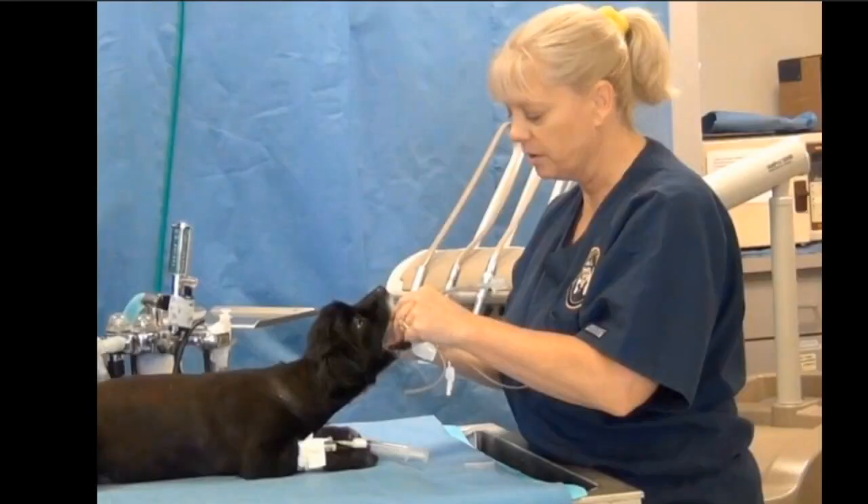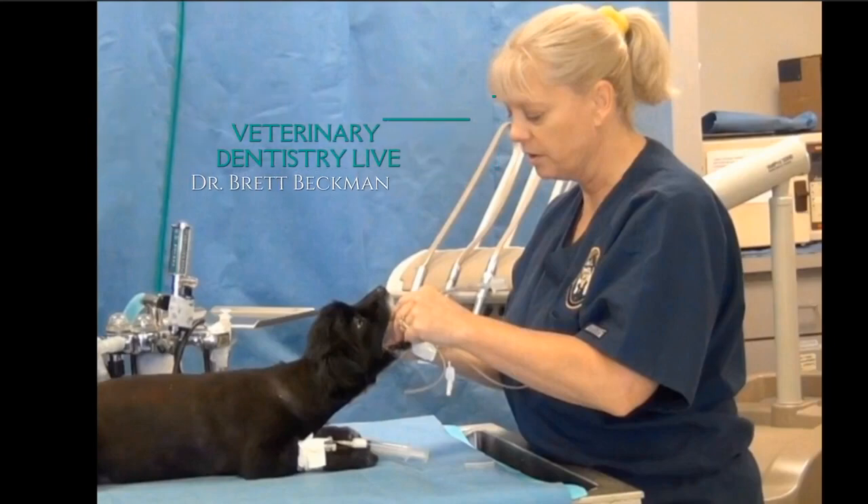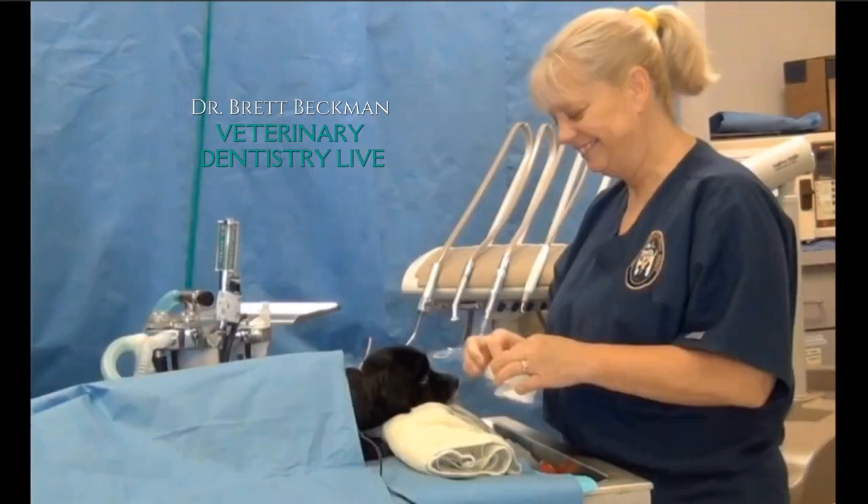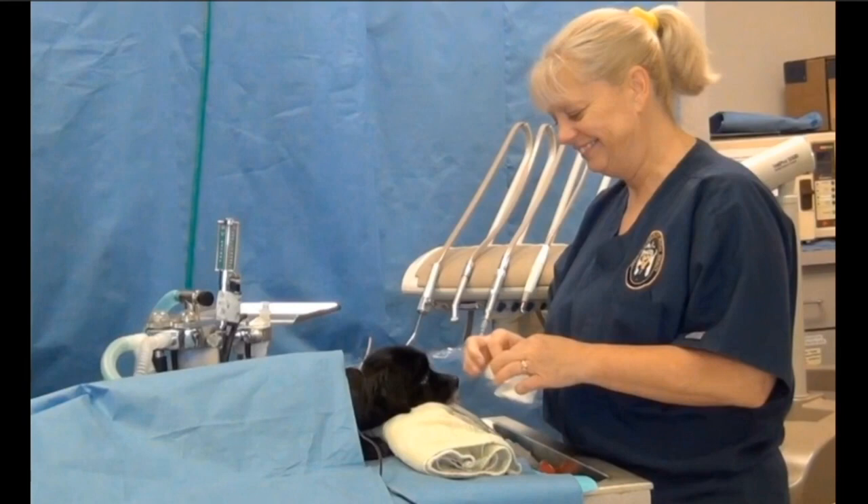So when we're intubating the patient, we induce the patient and they're in sternal recumbency. What we're going to do in a case like this is go ahead and just put a little towel underneath the patient so that the palate is parallel to the table. And that removes a lot of variables.